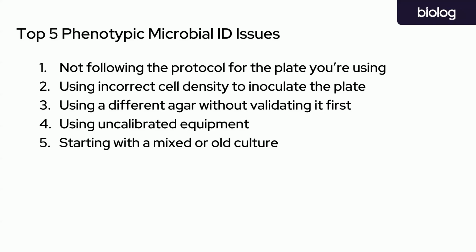For filamentous fungi, as soon as they start sporulating and there's enough spores to use, run your identification experiment. Try not to wait too long because some of those spores may start to become non-viable. Hmm, that makes sense. Okay.